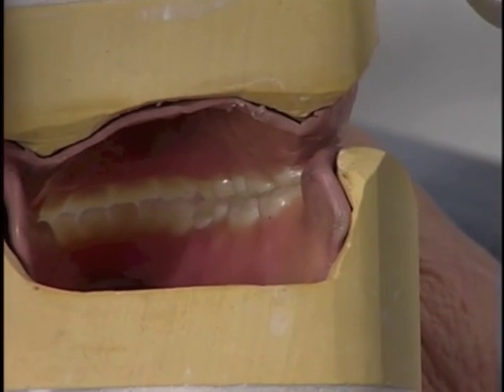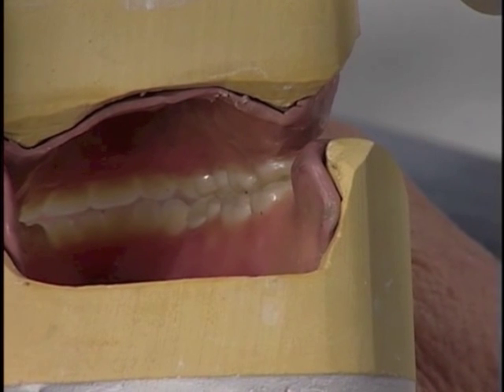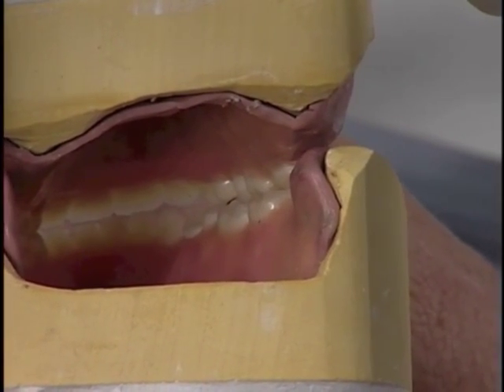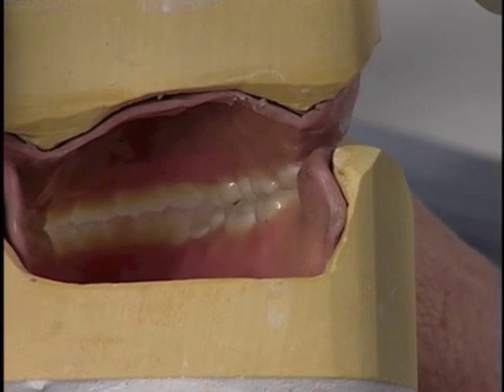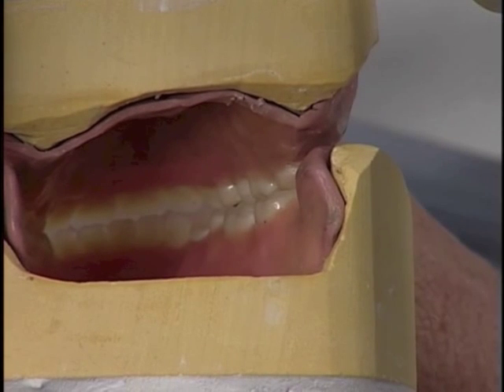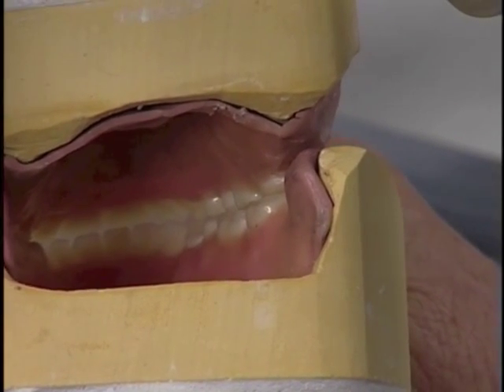If we put it into working relation, we have contacts of the maxillary lingual cusp with the mandibular lingual cusp. If we put it into non-working relation, the balancing side, we should have contacts of the lingual cusp of the maxillary posterior teeth with the buccal cusp of the mandibular posterior teeth.